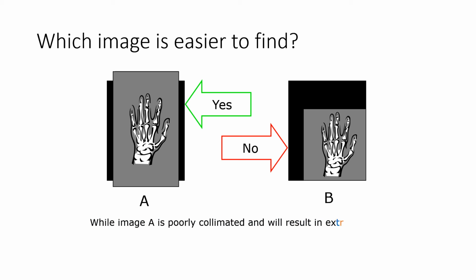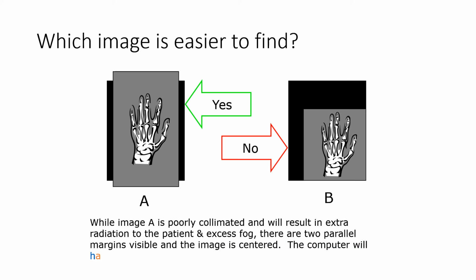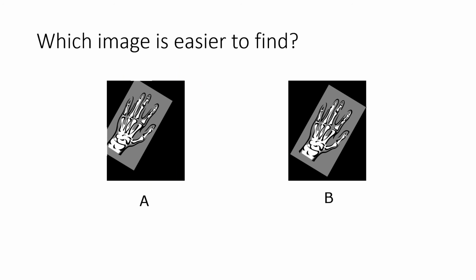Image A is the correct answer. Again, here are 2 PA hand images.